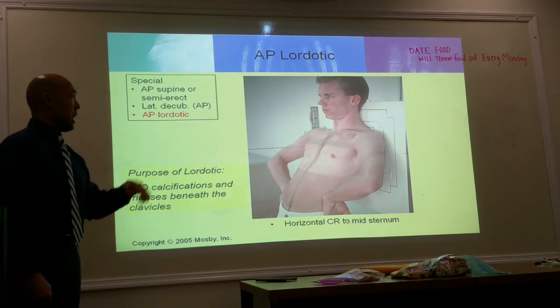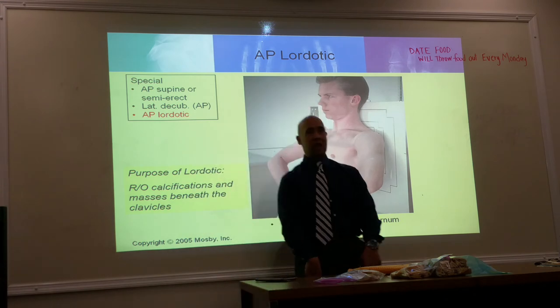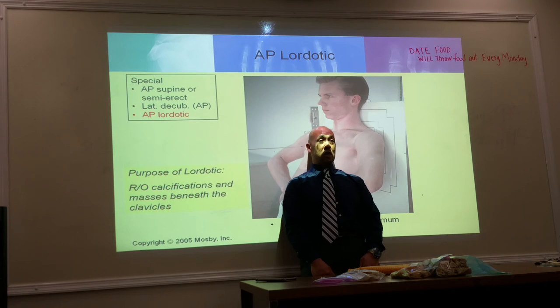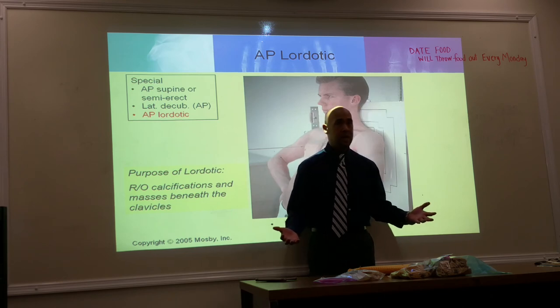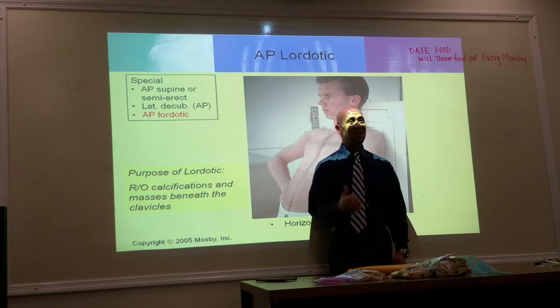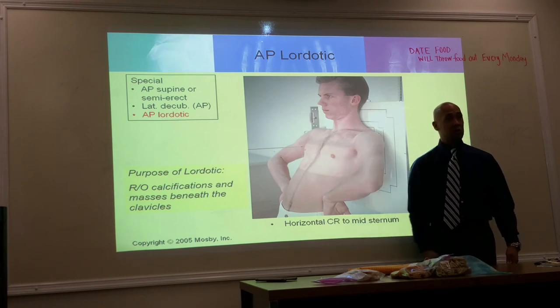Now another way that you can do this, and again, this is one of those tough positions. It's hard for the patient to hold this position, especially if they're elderly or have some kind of condition where they can't hold still for a long period of time. I'm going to do it like this. Now with the patient upright like so, what type of adjustment do I need to make? Angle your tube. The x-ray beam going about 15 to 20 degrees cephalad.